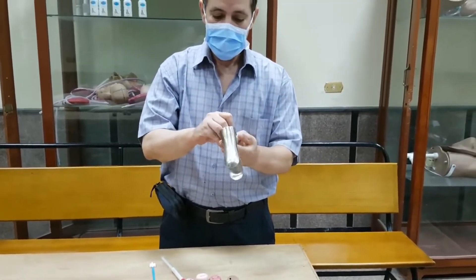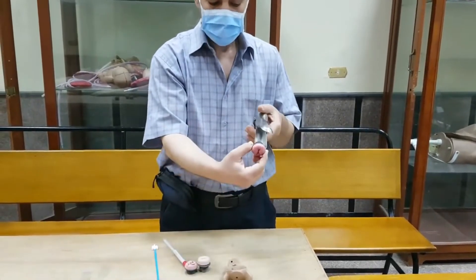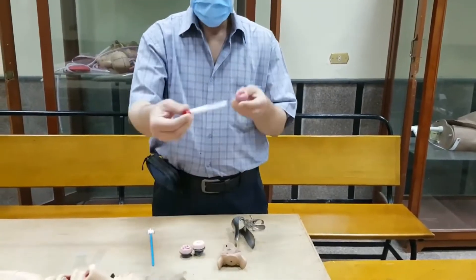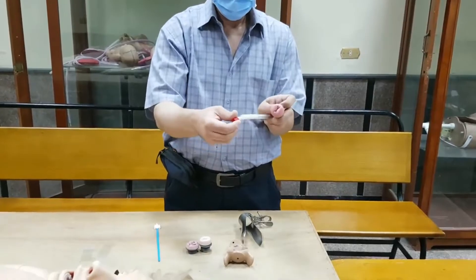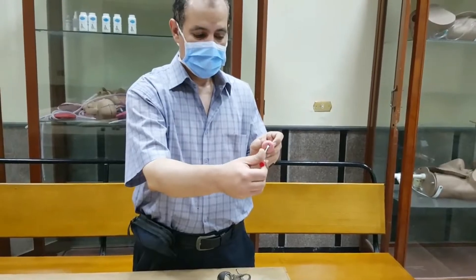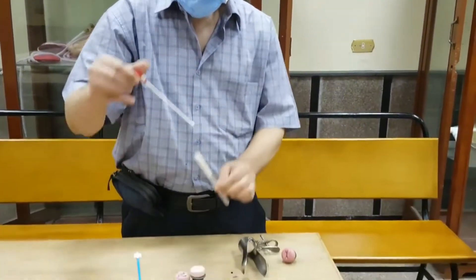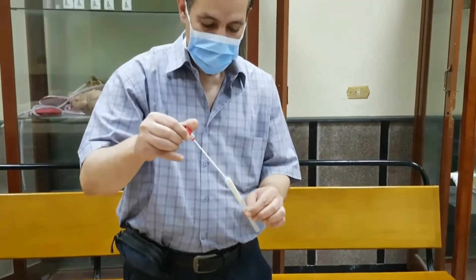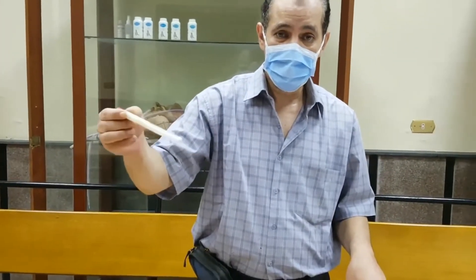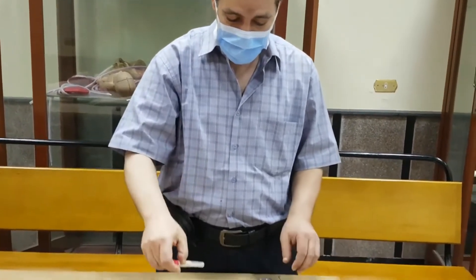Now I am seeing this part, which is the ectocervix. Then I have a cotton-tip swab; I take the swab from the external os like that, I rotate 360 degrees, then I withdraw the swab like that, then I insert it without touching anything inside the tube and I send it to the lab for examination under the microscope and for culture and sensitivity test. This is the cotton-tip swab for infection.